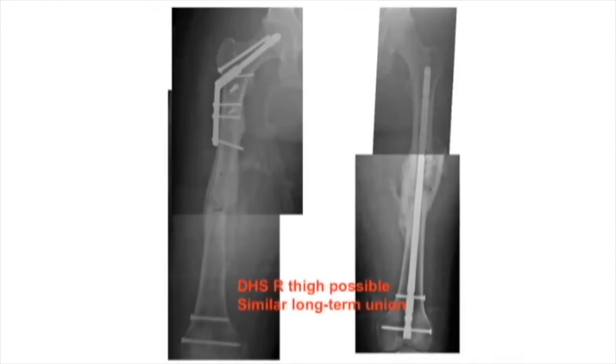Well, in a nail, it may or may not, because you're dealing with a load-sharing implant. But I think where the data could get translated very easily is when you look at a plate construct. When you look at a plate construct, we are always waiting for callus formation before we initiate weight bearing. That's really the go-to as to when we say, okay, fine, you have a relative stability construct that we plated. The moment you weight bear is when we start seeing significant callus formation and the alignment's maintained. Well, if we're seeing callus formation much sooner with a carbon fiber, then you can speculate that we can let them weight bear a lot sooner, which means that the rehab is going to be a lot quicker. There's going to be less muscle and skin atrophy, much more range of motion. It's overall very promising to be able to think that happening.